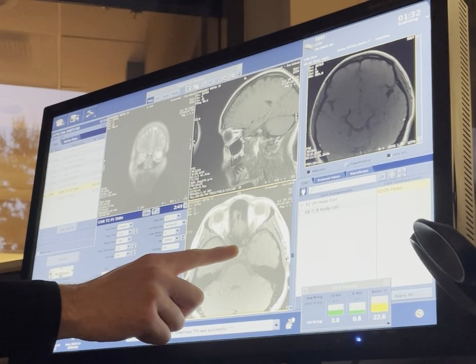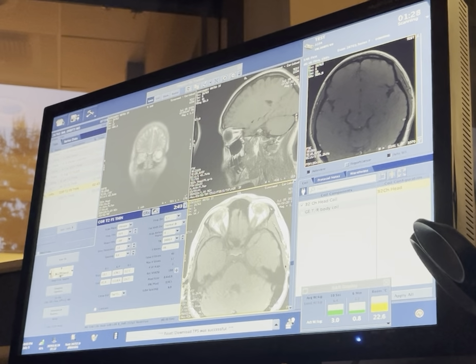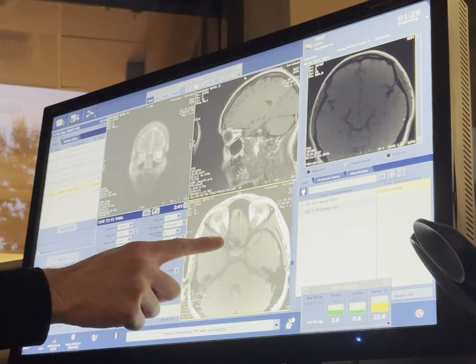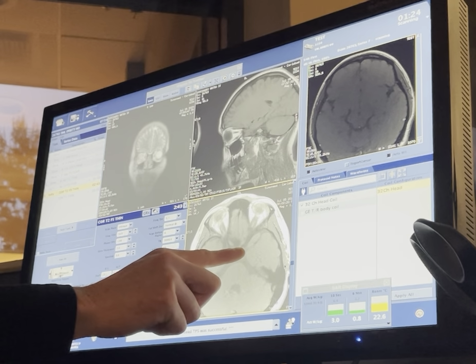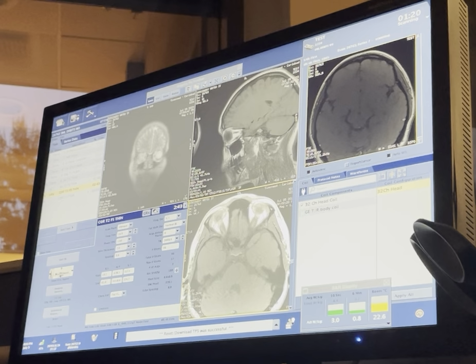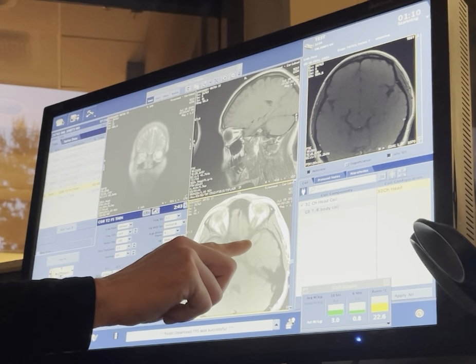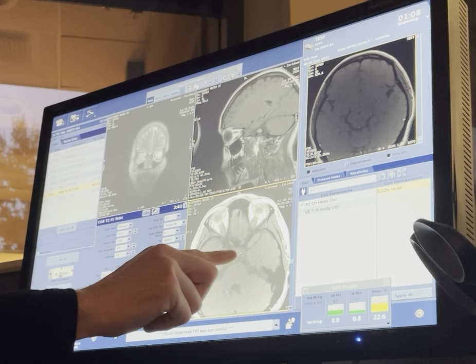They'll meet like right here. Here? Right there. It's really hard to tell, but you see them coming in right there, and they'll cross over right there. Is this the optic chiasm? That's the optic chiasm. Where does it cross? You see that line right there? Yep. And over here, and they'll cross right there, and they'll go.